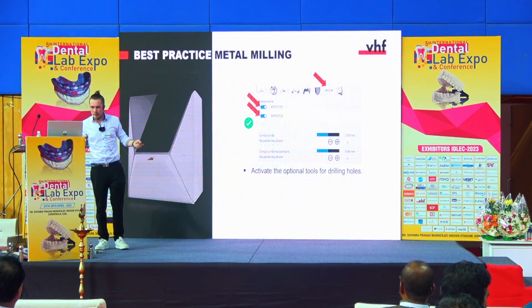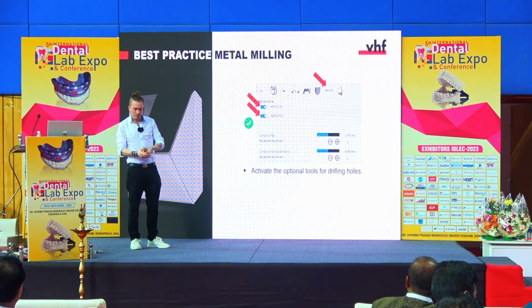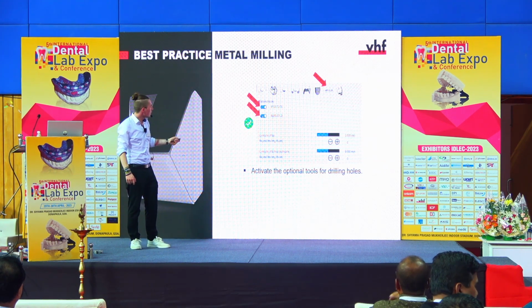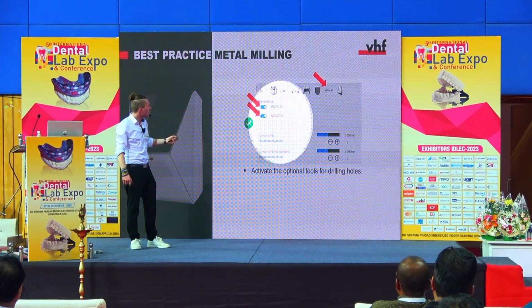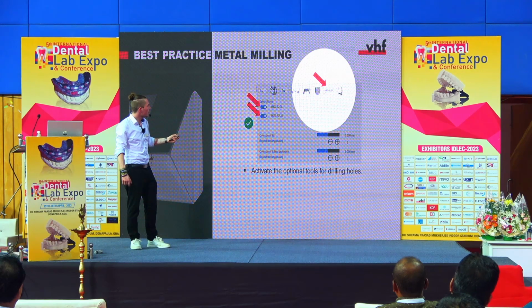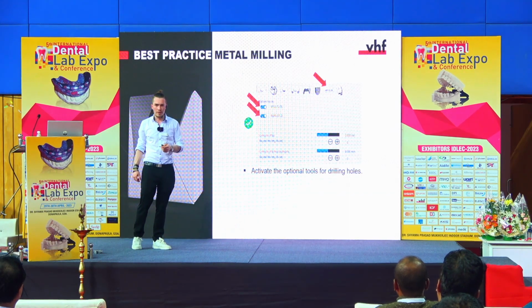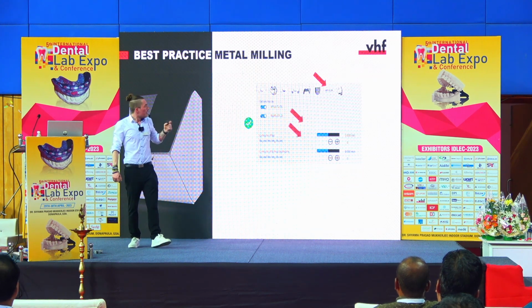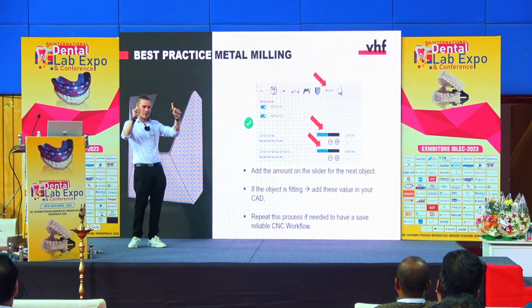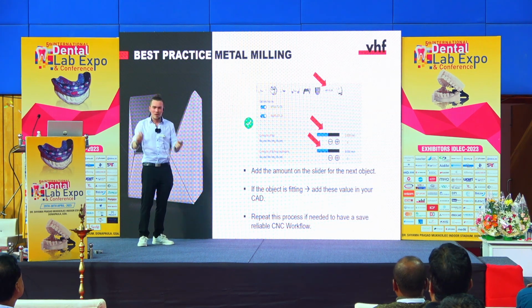So also for the people that are maybe already using our CAM software, as I already said, take a look here. You can activate optional tools. You have the button for the implant geometry, and there you can activate optional tools to later process the implant connection.